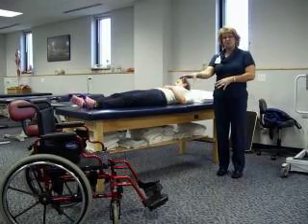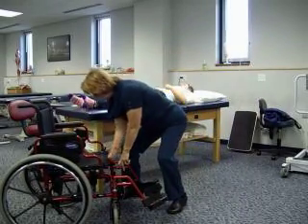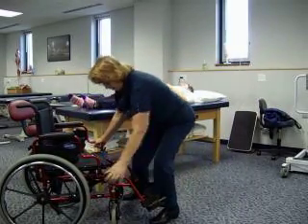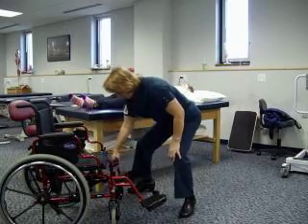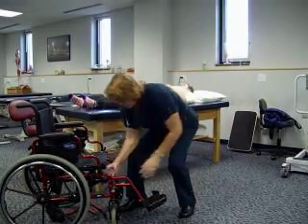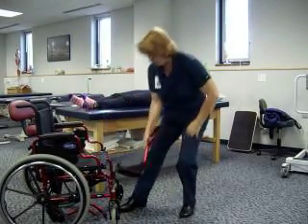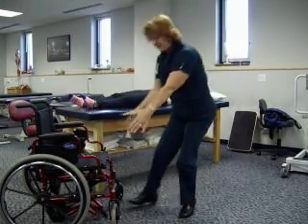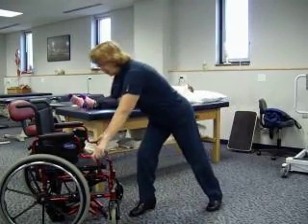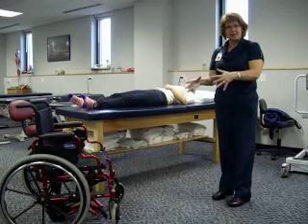First part of this, I'm going to make sure my wheelchair is ready. I'm going to make sure that it's locked. I'm going to get the footrests right off — not just swung out to the side, but I'm going to take them right off. That way, there's going to be room for the legs of the Hoyer to go past that section of the wheelchair. It's locked, double checked, in a good position — nearby but not in my way.